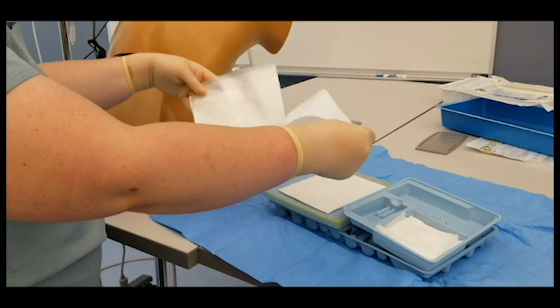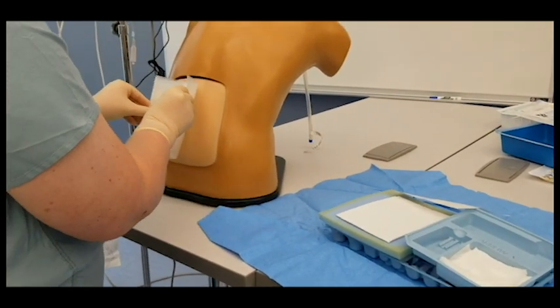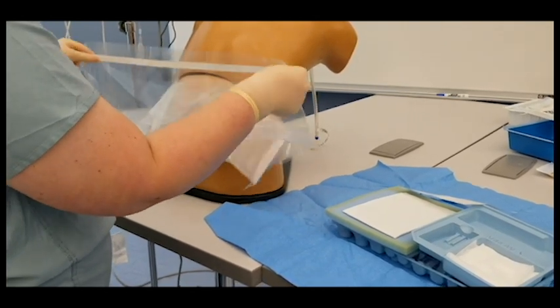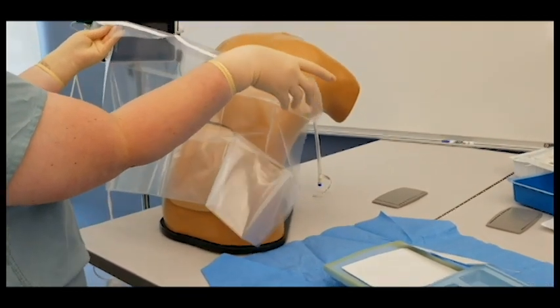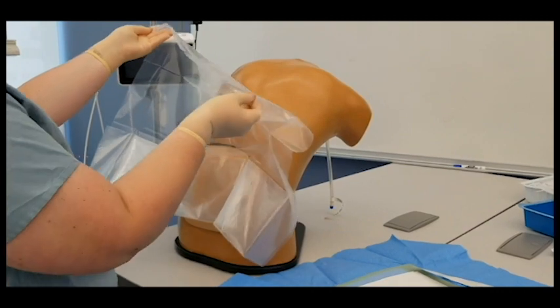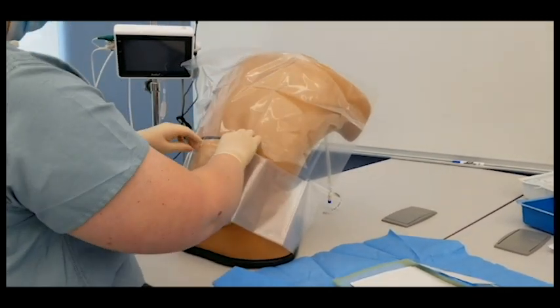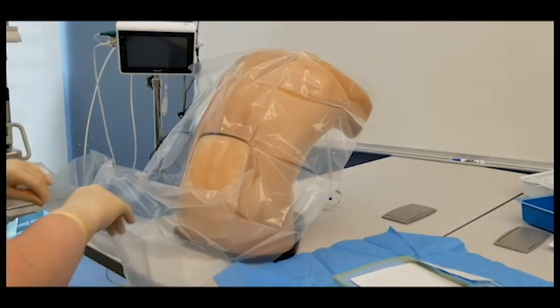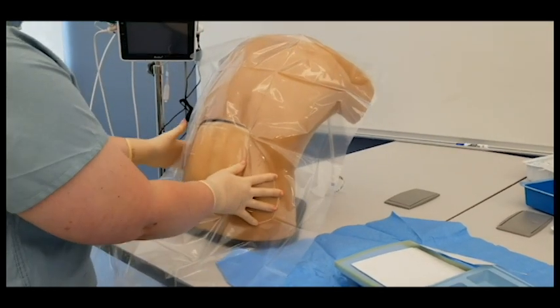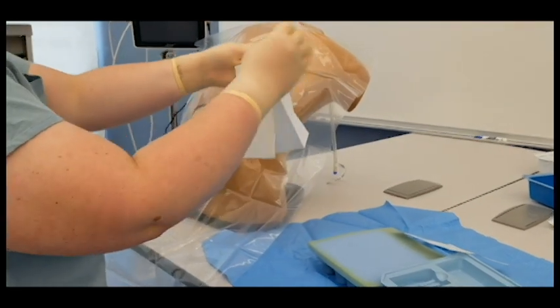Once skin prep is dry, open the sterile drape and place on patient's back. This is also a good time to reiterate to the patient the proper positioning. You may also feel your landmarks again and find the L3-L4 interspace.